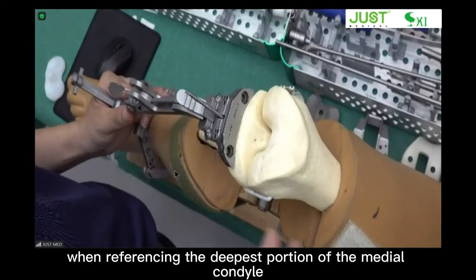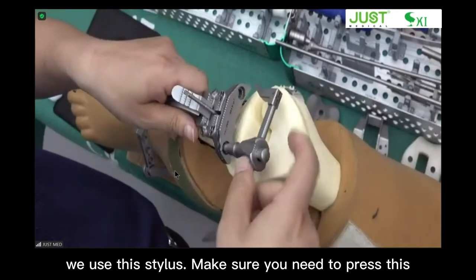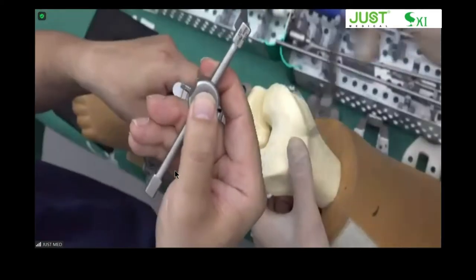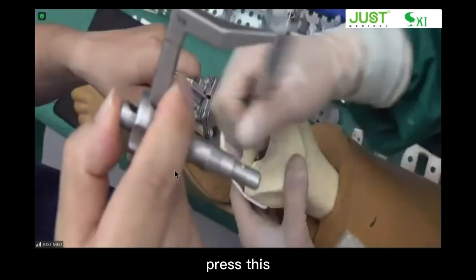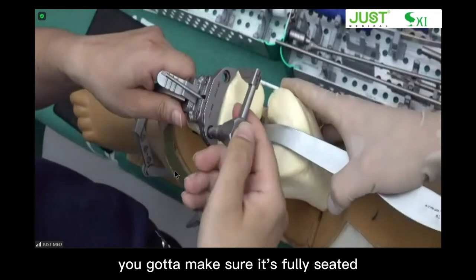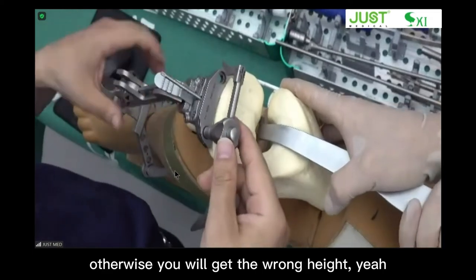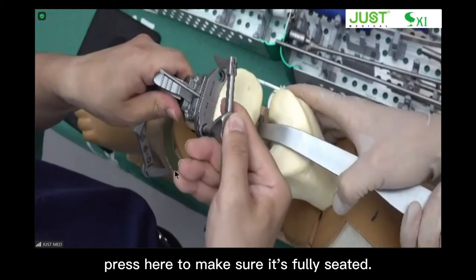When referencing the deepest portion of the medial condyle with this stylus, make sure you press this to the end. You gotta press it. You gotta make sure it's fully seated, otherwise you will get the wrong height. Press here to make sure it's fully seated.